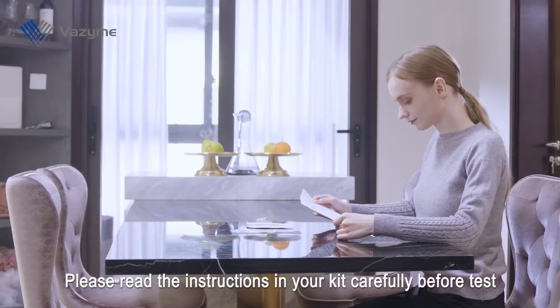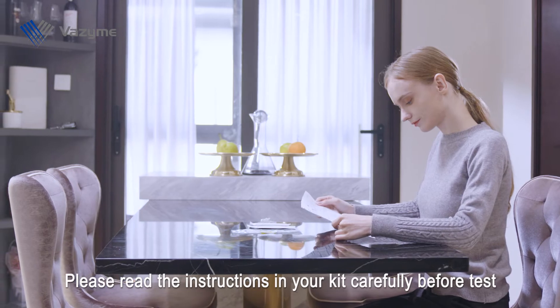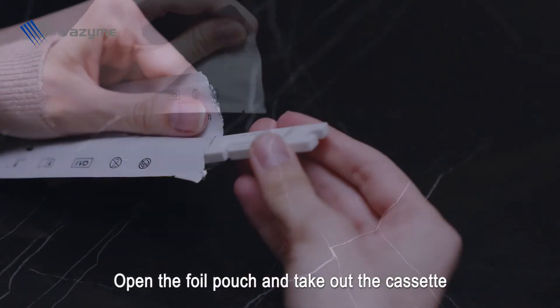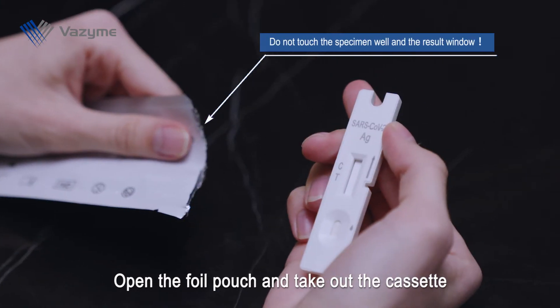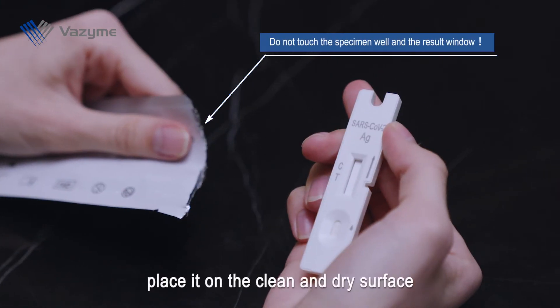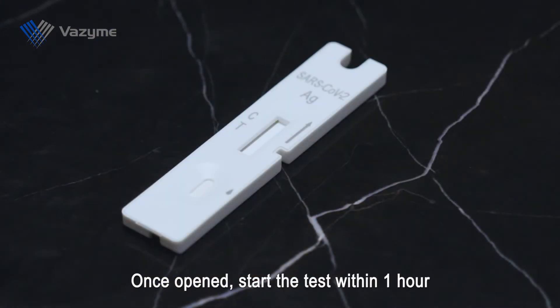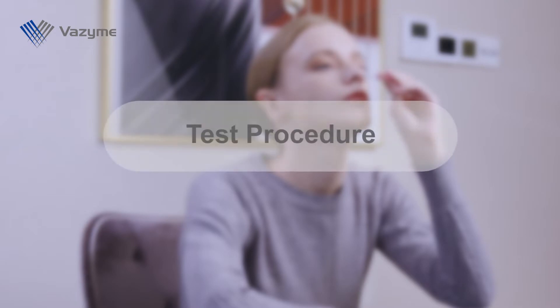Please read the instructions in your kit carefully before the test. Open the foil pouch and take out the cassette. Place it on a clean and dry surface. Once opened, start the test within one hour. Test procedure.